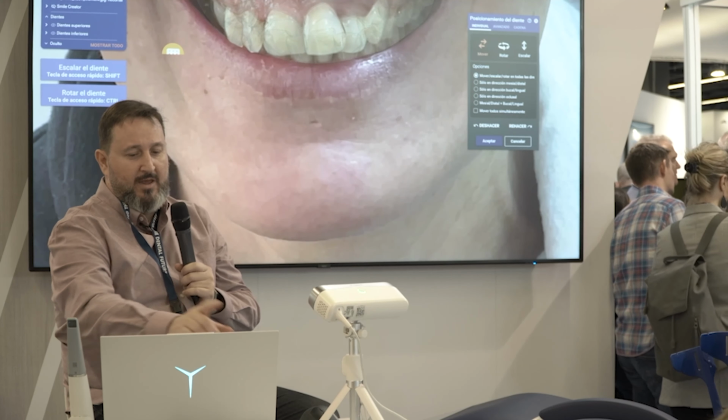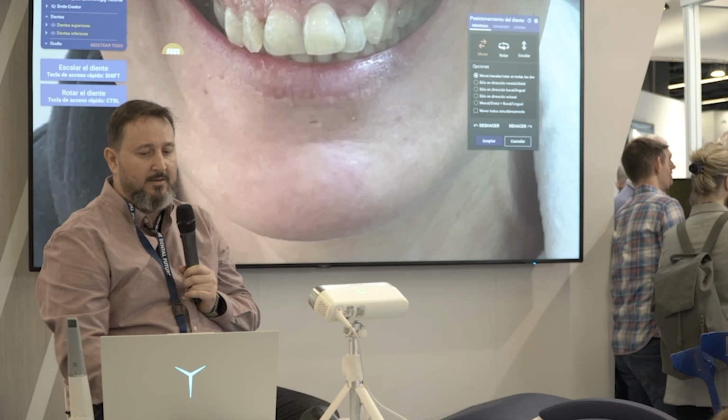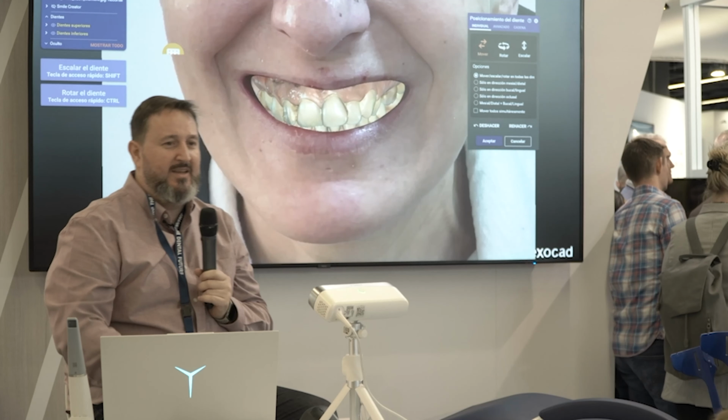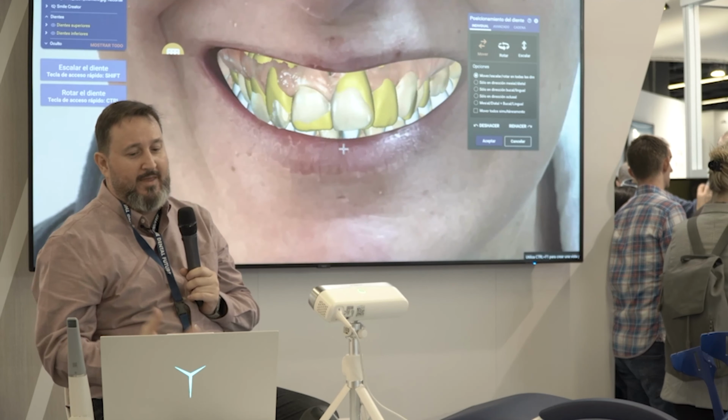There's everything in the front and the incisors. Okay, it goes right, but look what happens in the posterior tooth. Oh, there's a misalignment, and this makes our design blink to one part. Let's see what happens when we try to model. Okay, this is our daily work.